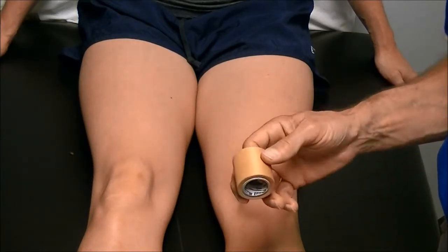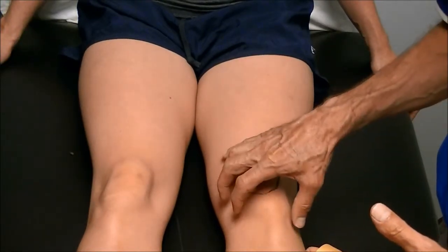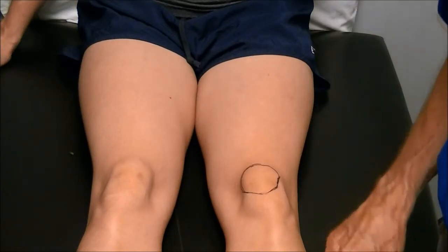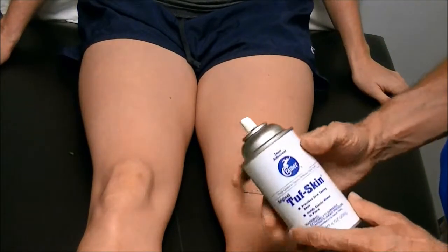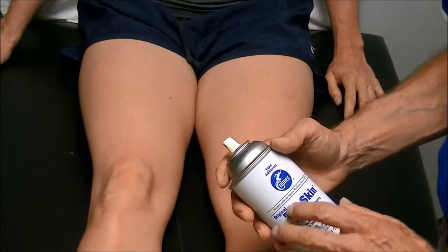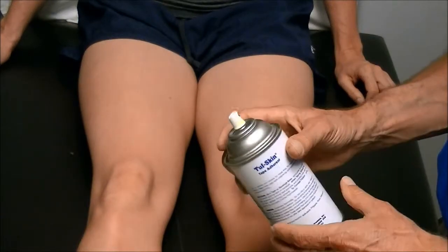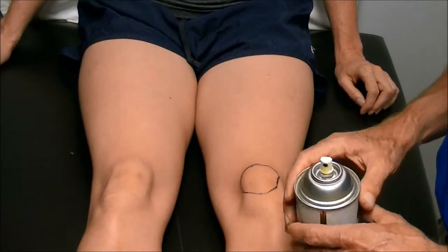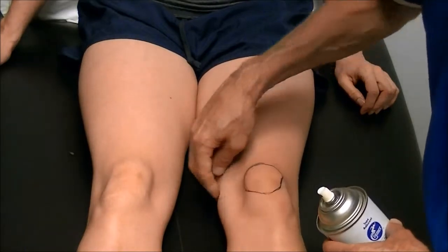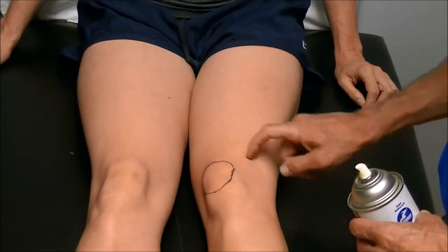Sometimes I'll put it on the knee for extended periods of three to four days. If it starts itching underneath the tape or starts getting really hot underneath the tape, you need to take the tape off because you're having a reaction to the adhesive on the tape or the adhesive spray. You have to use some kind of adhesive spray to get a good tape job, because if they are doing some kind of sports activity the sweat will take the tape off. This is Tough Skin; there's also QDA and all kinds of stick-em spray — they all have the same ingredients. The spray should go in front of the hamstring tendon here and come across the kneecap to about an inch and a half to two inches beyond the kneecap.